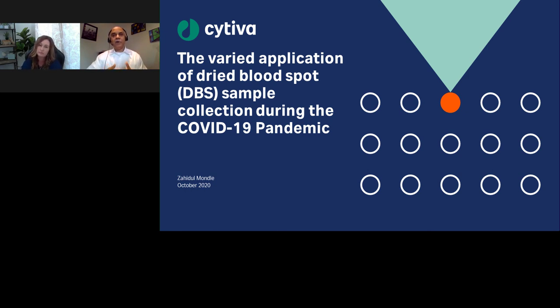Say finger pricking, at the time of finger pricking, the finger must be clean. Apply pressure during, say, blood is not dropping out and you need to apply a tiny pressure. During pressure, if your hand moves away from the circle, then you might spot somewhere else, and you need a large drop of free-flowing blood to collect. Sometimes when the circle is full, you have to remove your hand away. During the touching, when the blood is dropping from the finger, the card should be in contact with blood, and it is kind of tricky, and you have to maintain this properly.